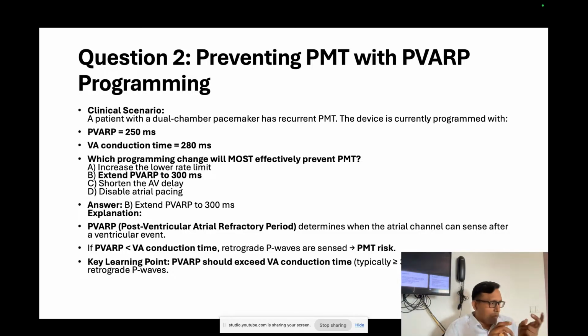Yes, you are correct. So two things are there. Blanking means totally blank. It is not going to see anything that is happening. In that period, it is totally off. Off means the timer is neither altered nor is it going to check any activity on the channel.